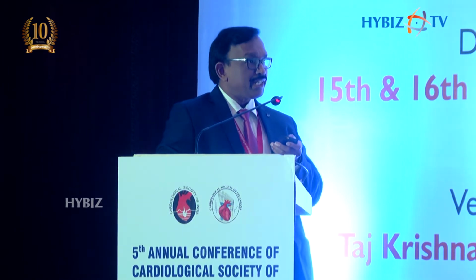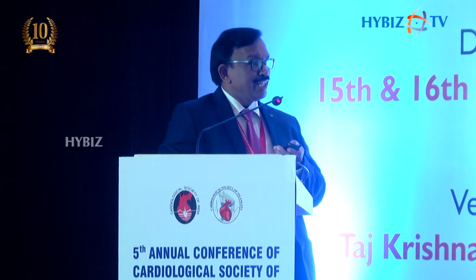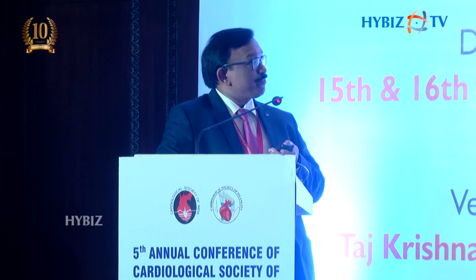Conventionally, for decades we have been measuring with one reading, or sometimes, very scientifically, 3 readings. Now the concept that has emerged is continuous blood pressure monitoring, or ambulatory blood pressure monitoring, done either half-hourly or hourly as per the different protocols, then taking the average or mean of that and establishing the diagnosis of hypertension. That is the basic concept of ambulatory blood pressure monitoring.